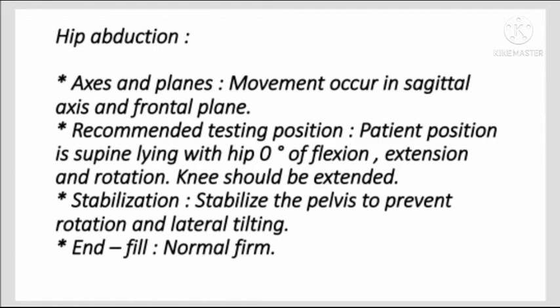Patient position is supine lying with hip 0 degrees of flexion, extension and rotation. Knee should be extended. Stabilization: stabilize the pelvis to prevent rotation and lateral tilting. End feel is normal firm.